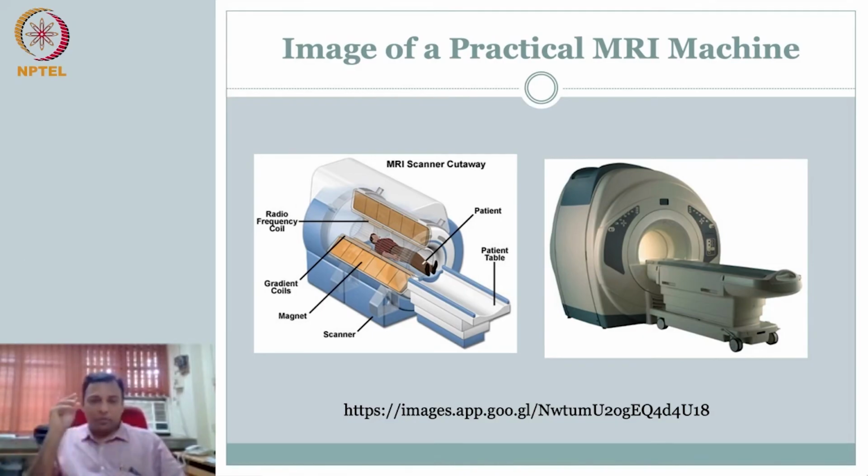Here I'm going to make a switch because the patients are not standing, right? They are lying down in the bed and going in. So starting now, in almost all reconstruction and all the analysis that we will do, we will relate the axis of the patient going in as the Z axis. And therefore the axes are now rotated.